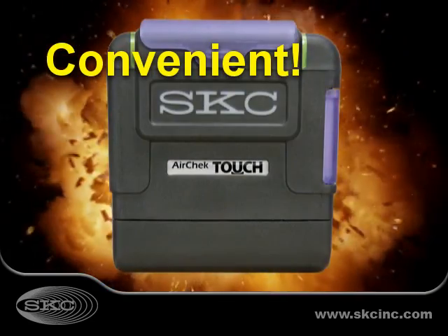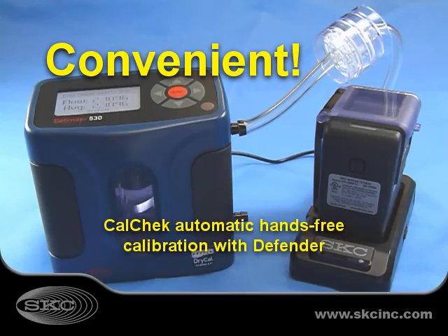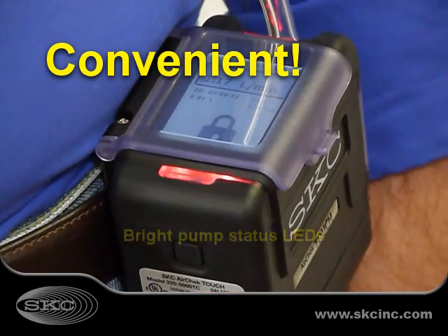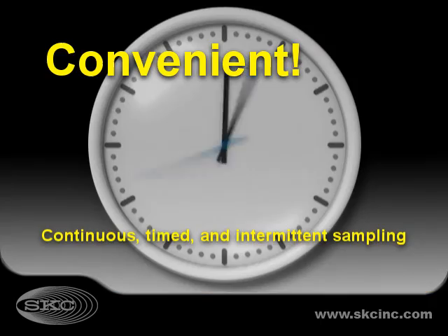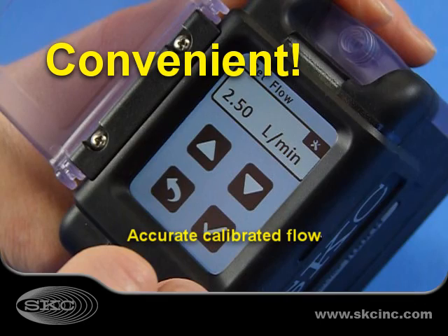The most user-friendly pump on the market, AirCheck Touch features charging, calibration and communication with Cradle. With automatic hands-free CalCheck calibration, real-time display and LED pump status indicators, AirCheck Touch offers the features you want while providing accurate calibrated flows.